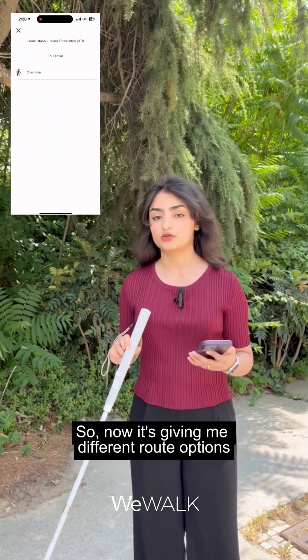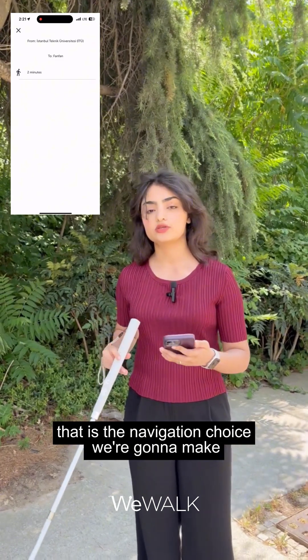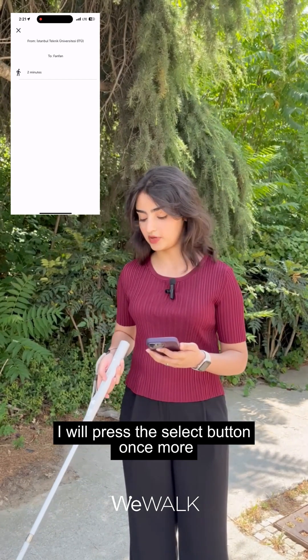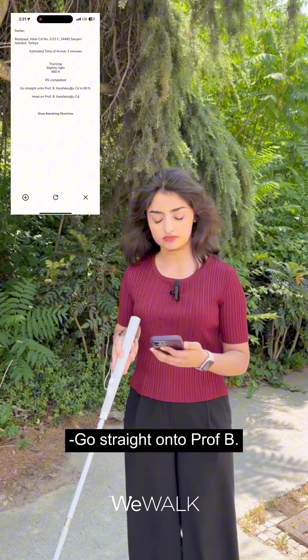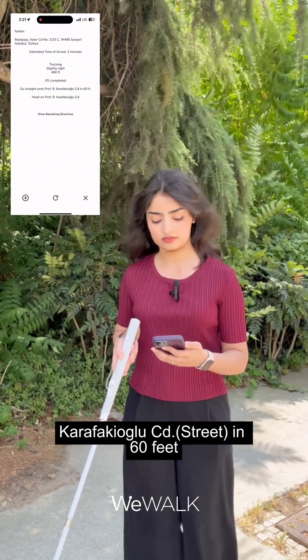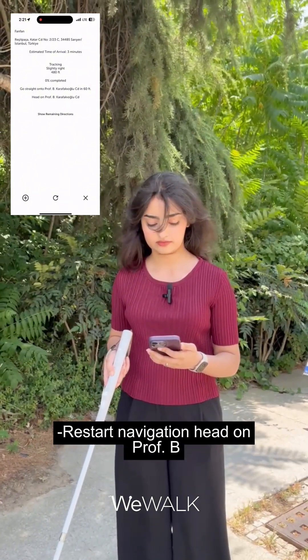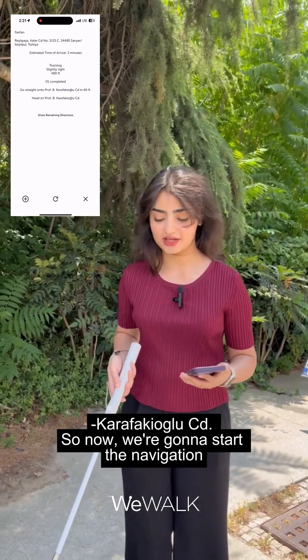Now it's giving me different route options, but since this place only has the walking option, that is the navigation choice we're going to make. To select that and start it, I will press the select button once more. The cane announces: 'Go straight onto Professor B Karavakiolu CD in 60 feet — target is 480 feet away in the slightly right direction.' So now we're going to start the navigation.